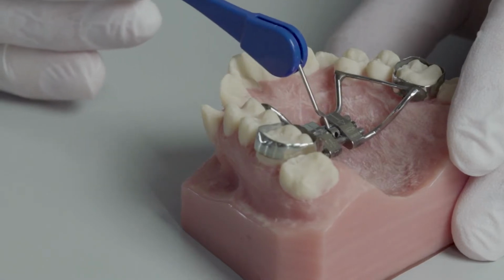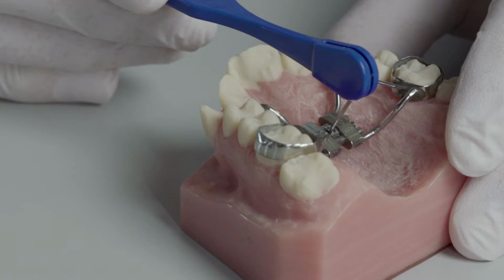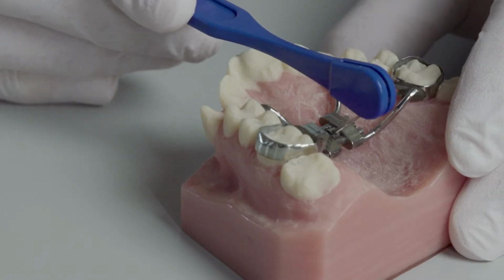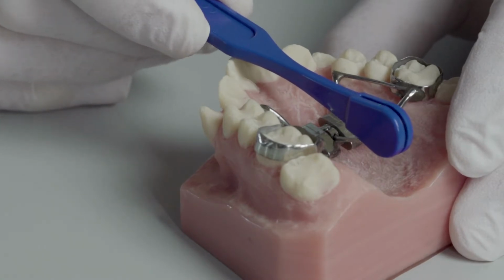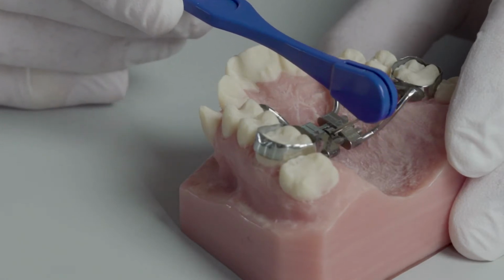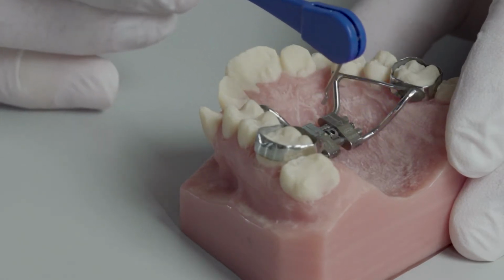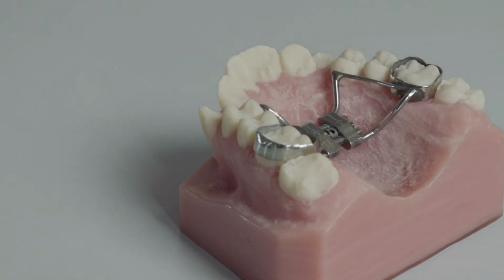The two most common problems you may have in making a turn are, first, doing an incomplete turn, where you don't turn the key all the way towards the back of the expander. The problem is that the next hole won't be visible to do your turn the next night. The next most common problem is, after you've completed the turn, removing the key and reversing some of the turn that you've just done. Again, it will make it so that the hole is not visible for your turn the following night.